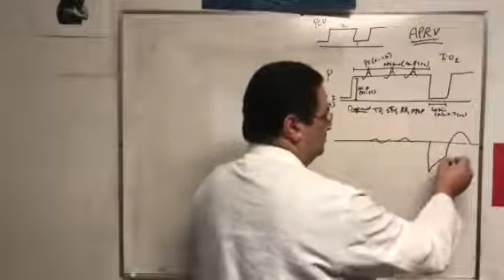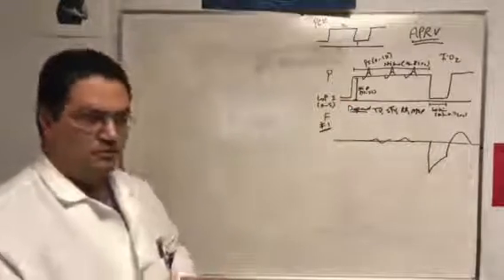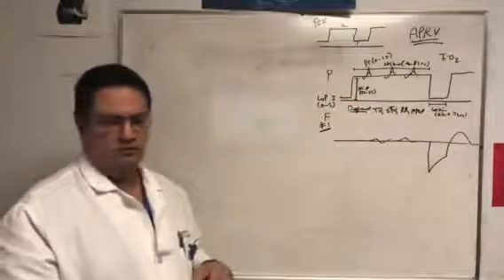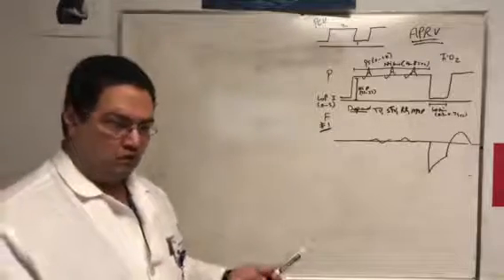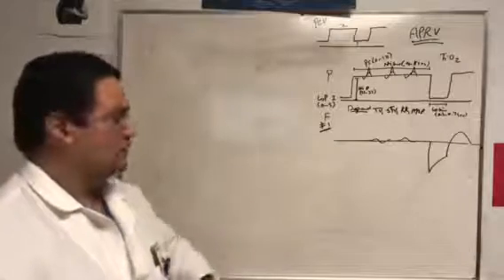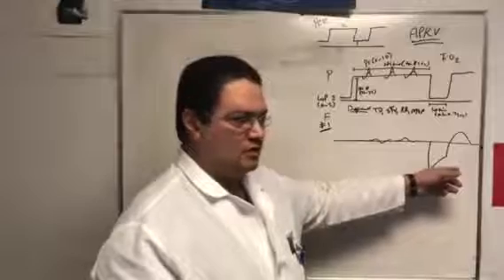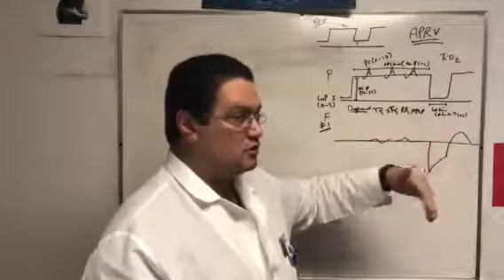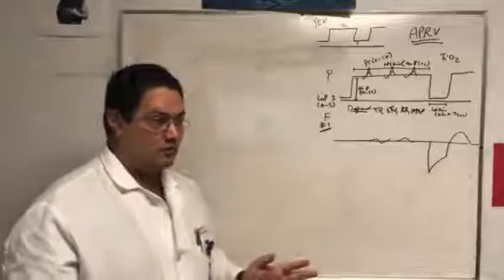So what do we call this in other modes of ventilation when the exhalation looks like this? We call it auto PEEP. The exhalation is not complete. That's auto PEEP. So if we call it auto PEEP here and the respiratory therapist measures it, he will have a heart attack because the auto PEEP here is huge. 45, 50, huge auto PEEP, right?